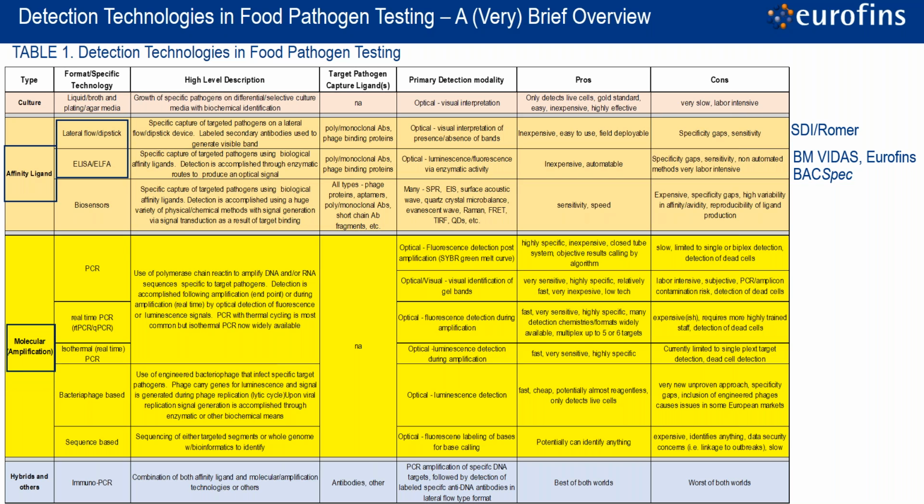And then in the molecular technologies, of course, you have all the PCRs. And then, of course, these are very complex in and of themselves, and an entire talk could be done just going into the different types of PCR that are available.